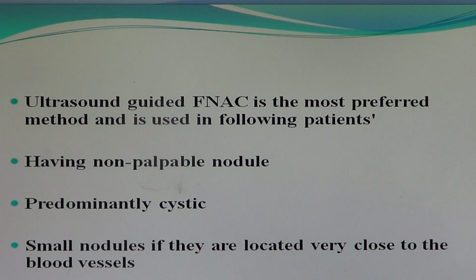Ultrasound guided FNAC is the most preferred method and it is used in the following patients: those having a non-palpable nodule, predominantly cystic nodules, and sometimes small nodules if they are located very close to the blood vessels.